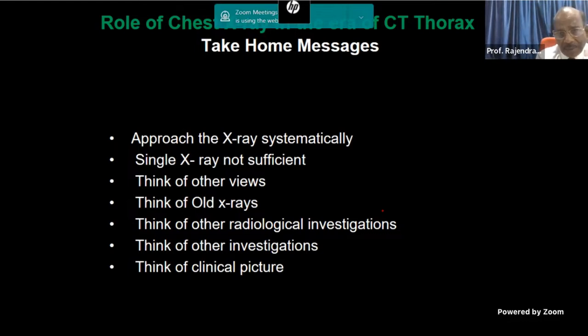Many people are not in the habit of calling the patient with old X-rays. Please see the old X-rays, that might help you in deciding the diagnosis and further treatment. And not only X-ray can tell you everything, think of other radiological investigations. Think of other investigations, not only radiology, you've seen the CT picture, other investigations like bronchoscopy. And overall, if you are still not clear in your radiology, think of the clinical side, which people are forgetting. That's why I put the YouTube link on how to take history. If you take the history, many points will come out to you, and you may think, what is abnormal?